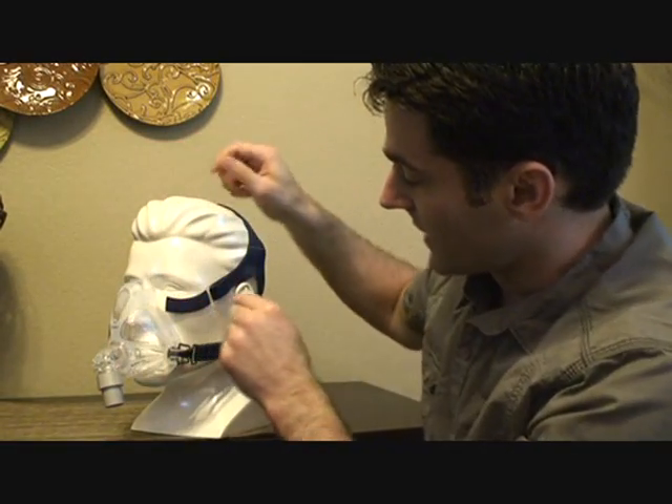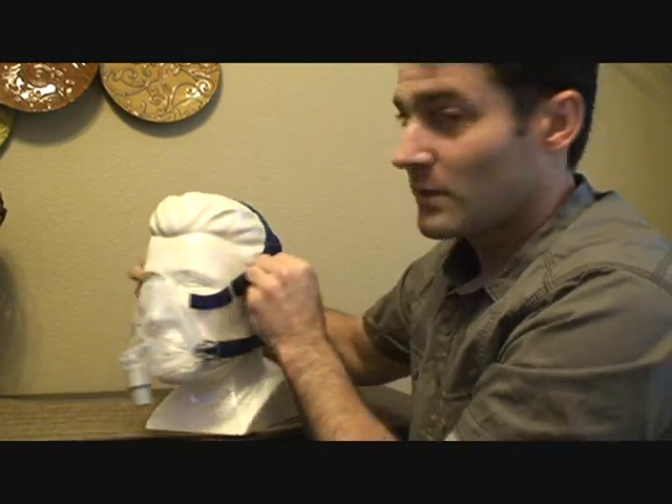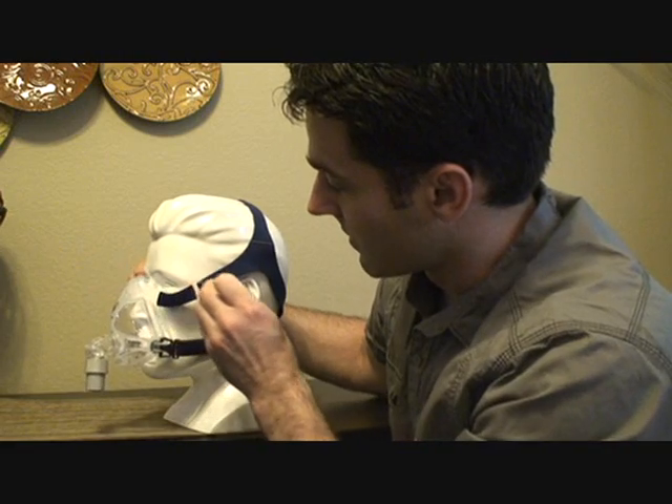Most masks have some kind of a piece up top where you pull it tighter. On this one, the headgear holder is actually specially designed so that when you pull on each side and tighten it, that is what controls how tight it is.